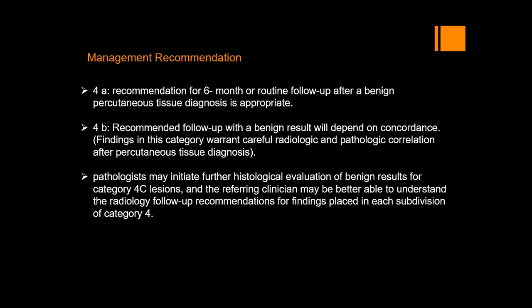So the management recommendations for BI-RADS 4A: after a percutaneous biopsy with a benign result, just a 6 months follow-up. It is probably benign, just follow it up after 6 months.